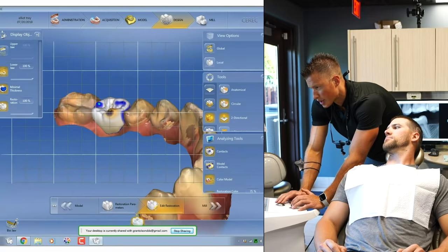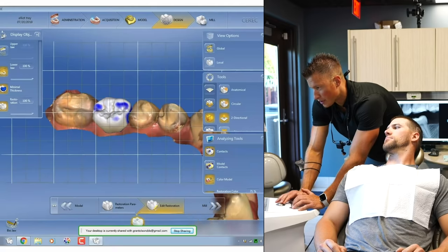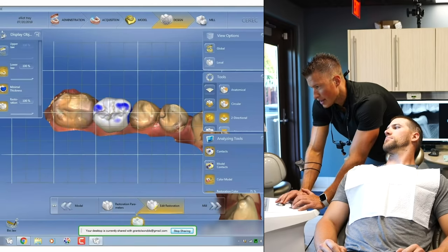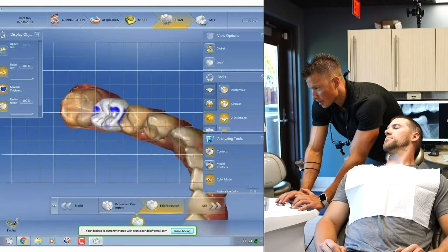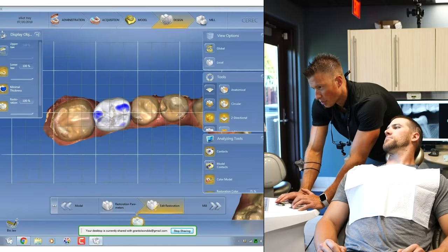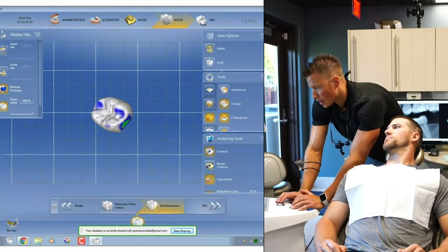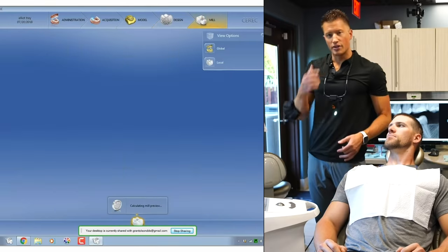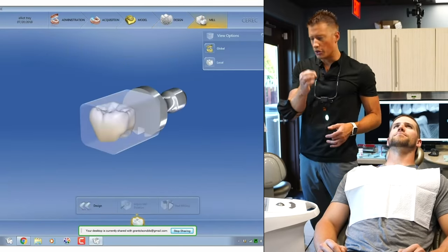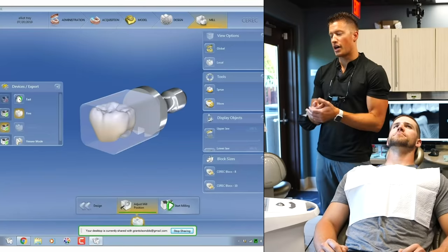There are a lot of different views on that. After placing over 500, almost 600 implants, my experience and some of the situations that I've been able to treat, I've come up with an opinion that if you've got a fracture or a broken tooth from trauma, we're talking about no possibility of any sort of infection at the root of that tooth, especially in the cosmetic area, we can actually take the tooth out and place the implant immediately.